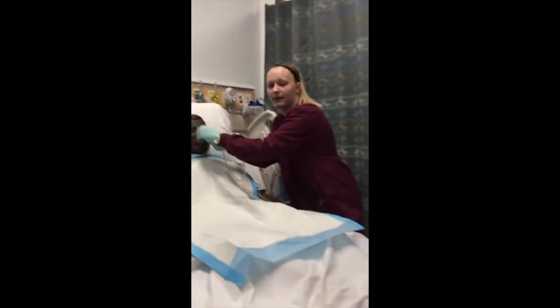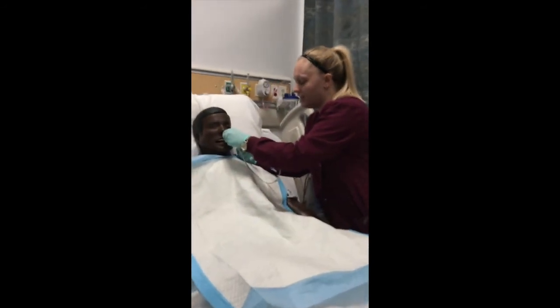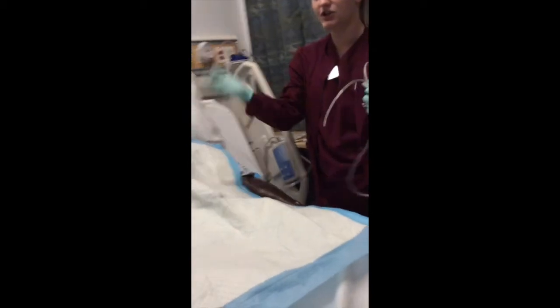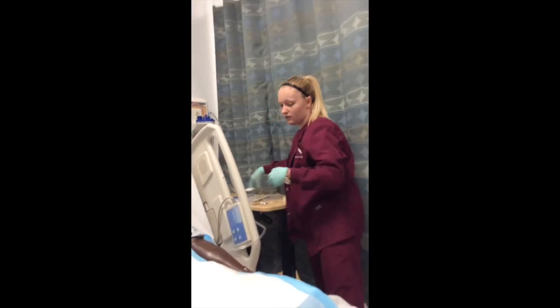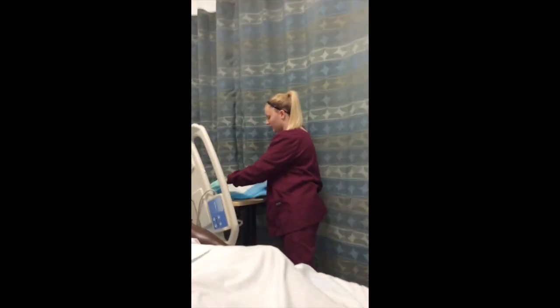Alright, so I'm about to take it out. Okay, ready? Take a deep breath in, and hold it, and okay, and they have the tissue to wipe their nose off and everything, and I'm going to document the removal after I've done this. I'm going to document that it came out in one piece, no problems, no complications.